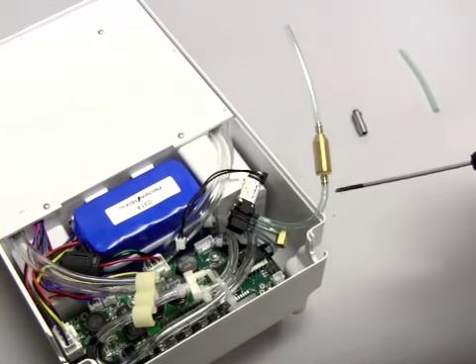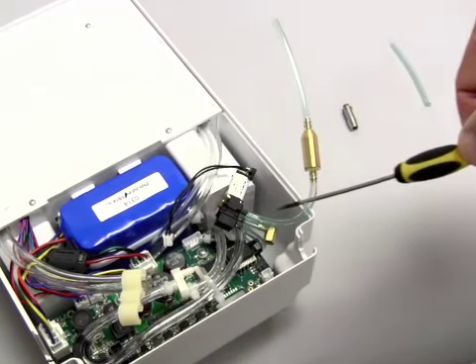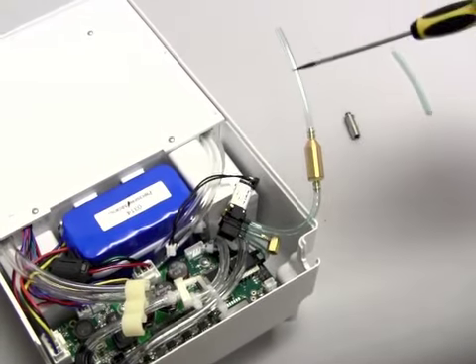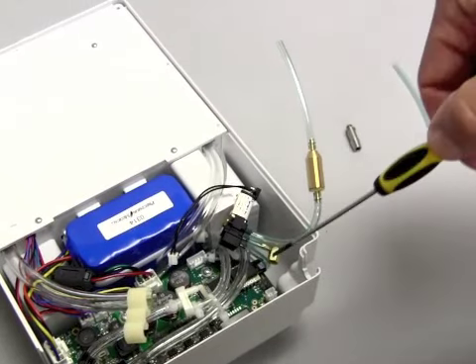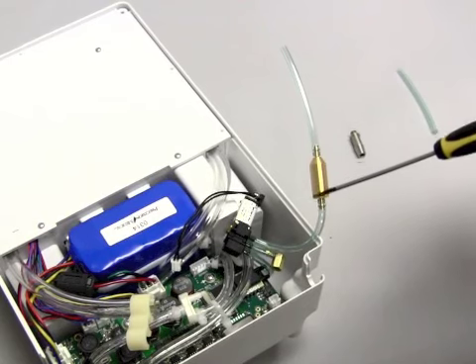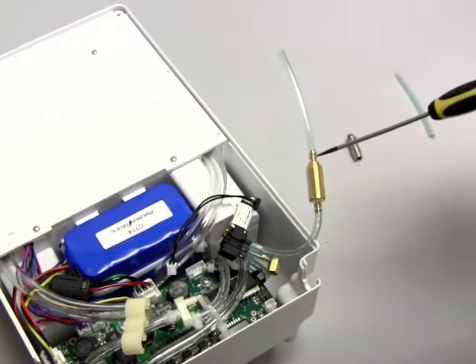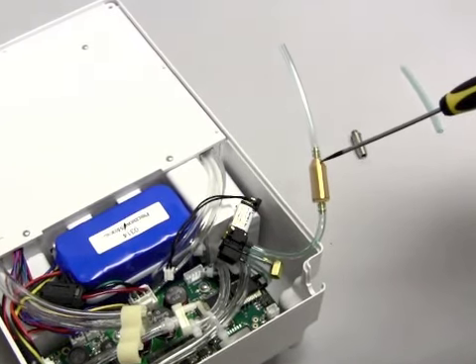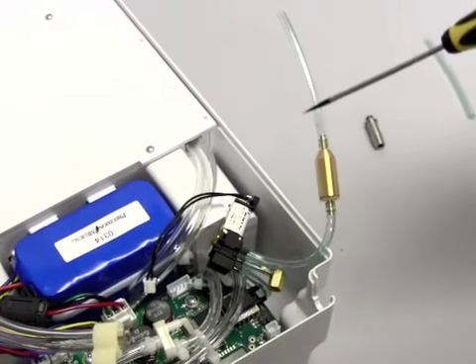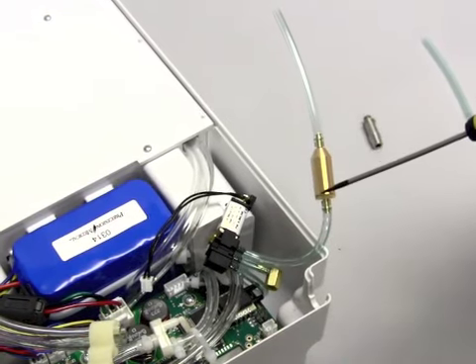This shows that I've installed the isolation valve onto the tubing from the three-way valve, and then this piece of tubing is going to connect with the pressure sensor on the board. This is a critical step, and something you have to pay attention to is that the cone shape of the isolation valve goes towards the pressure sensor on the board. It's critical that they go in this direction.